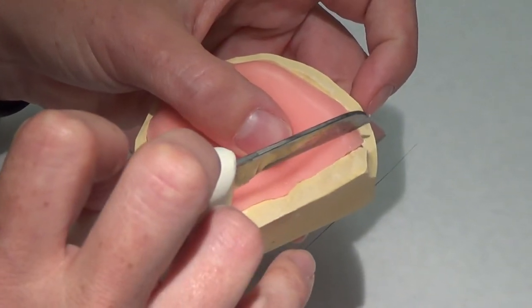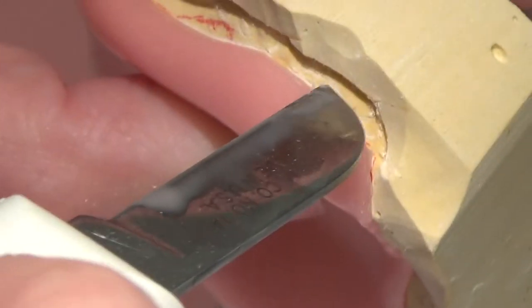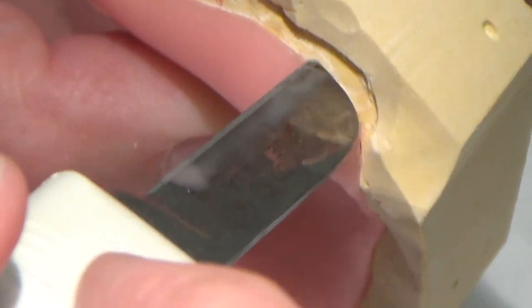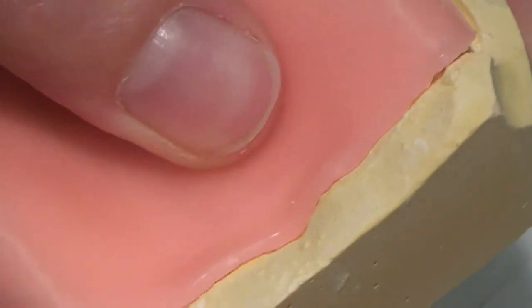But talking about the area that extends beyond the level of the tray. So if I'm short here, that's a problem. If I'm short here, that's what I want. I want to be short here so I can add material back. I don't want to be trying to make my tray longer. I need my tray to support my material.